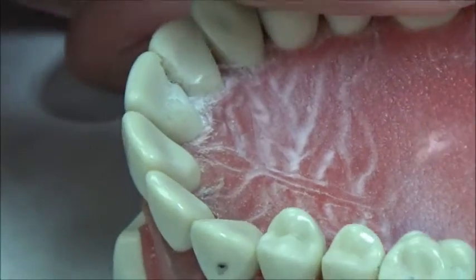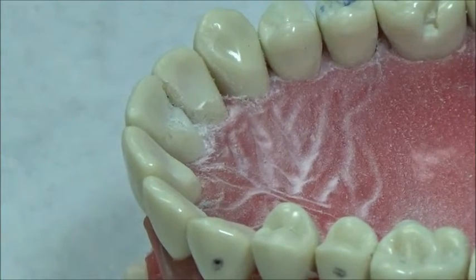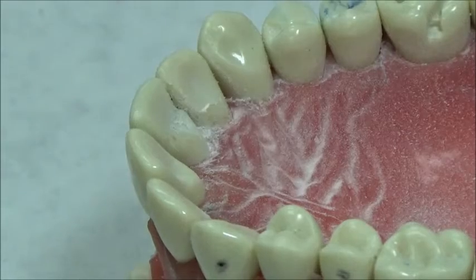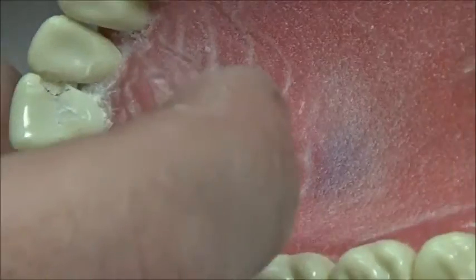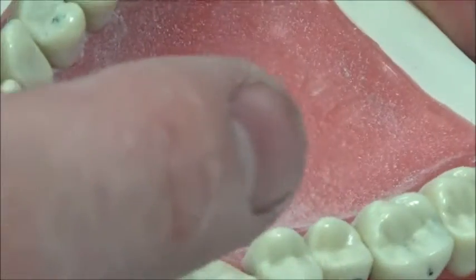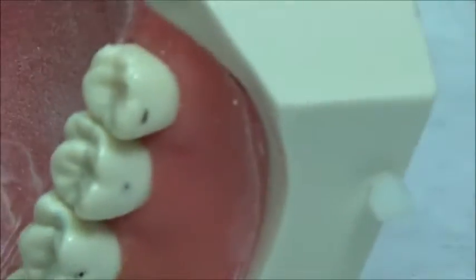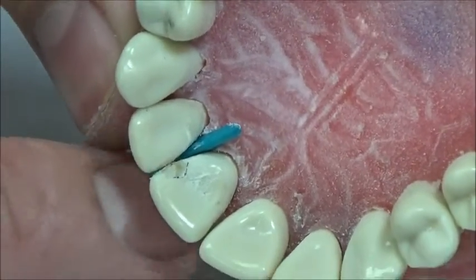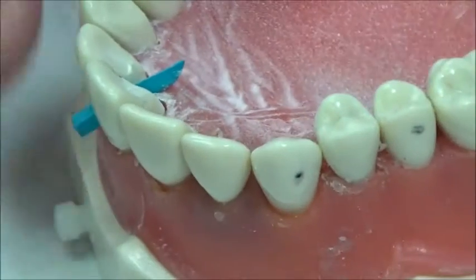I'll come in here and scrape off some of this. One thing you can try — if you have wedges and you don't want to nick the adjacent tooth — is to put a wedge in here. That'll very gently break the contact for you, very slightly, so you can go back in and have a little bit more wiggle room.